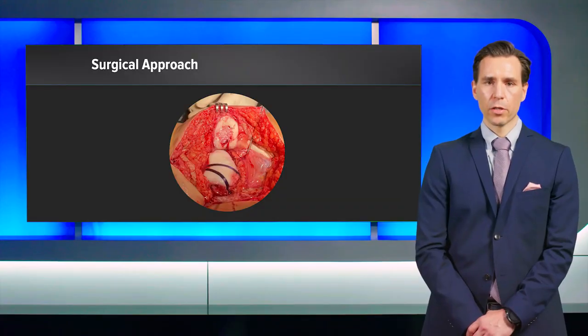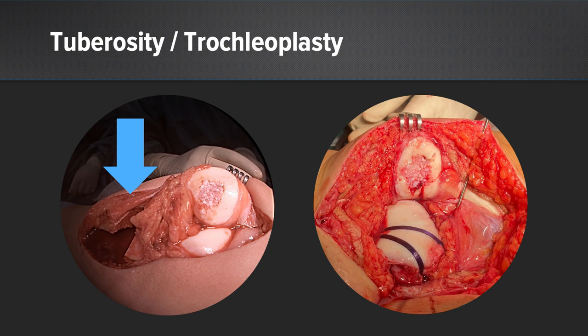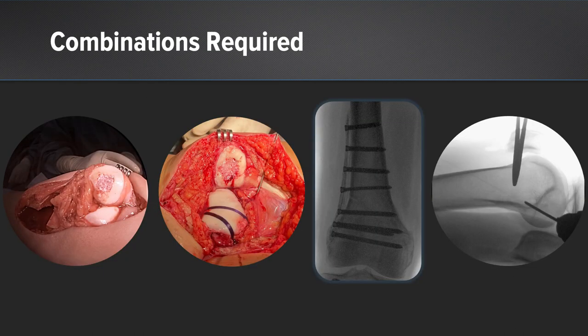So the final appearance of the surgical approach was maximally invasive, but very effective as a one-step procedure for the patient, addressing the trochlear dysplasia as well as the patellar defect, which is very often seen in combination. In such cases, it is often required at the same time to perform a tuberosity osteotomy and in selected cases to perform a varus producing or even derotational femoral osteotomy. Also, in many cases, finally, to close up the knee joint, performing an MPFL plasty.